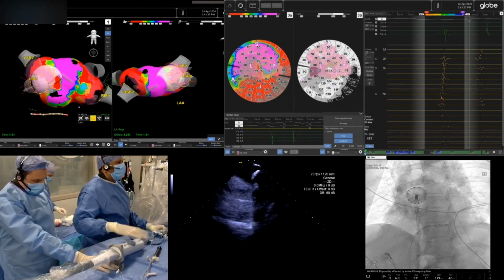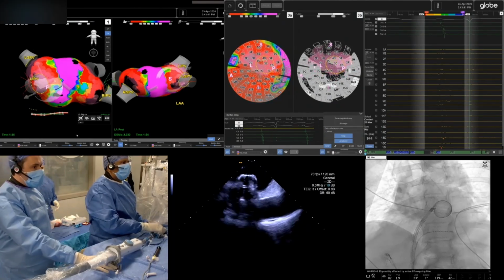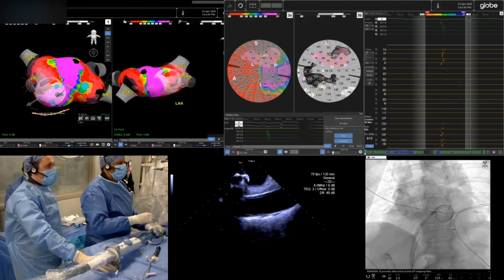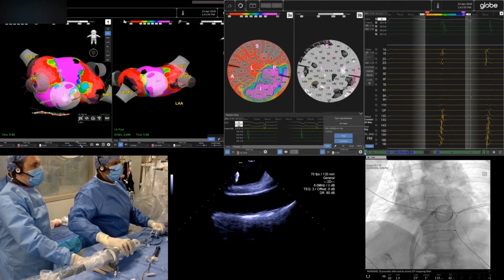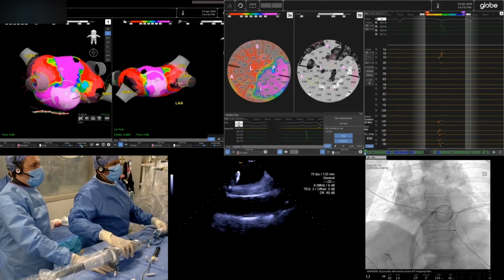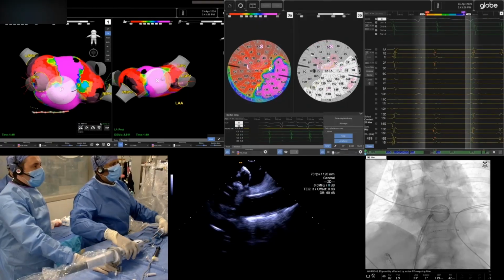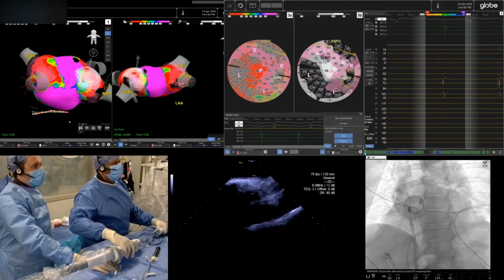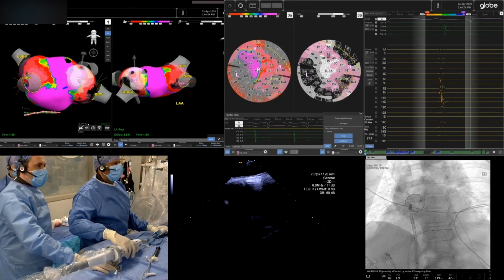There is, in the community again, a question about too many choices for PFA. We don't know what to use. But Vivek or Srini, this is another tool, and we are seeing good potential for this as well. What if you have a true paroxysmal patient with a very small atrium? Would you have a problem with maneuverability, or would you say maybe two movements and you're done?